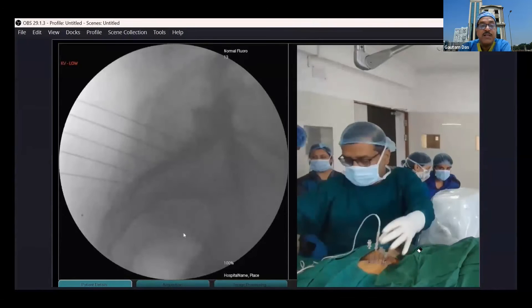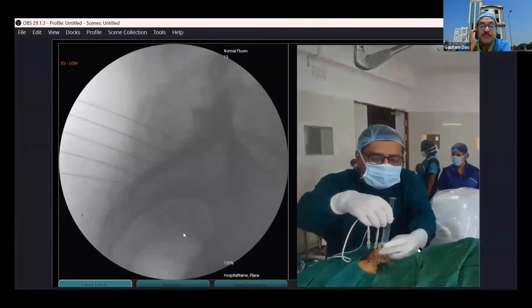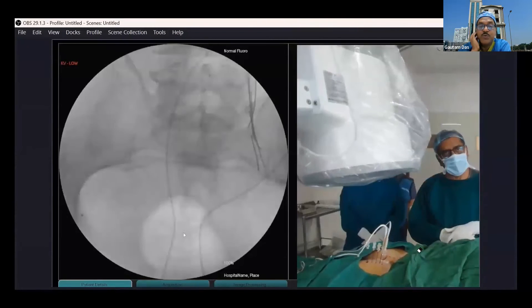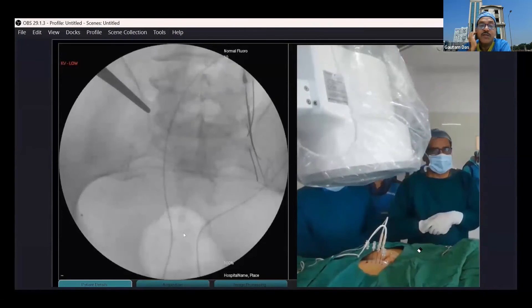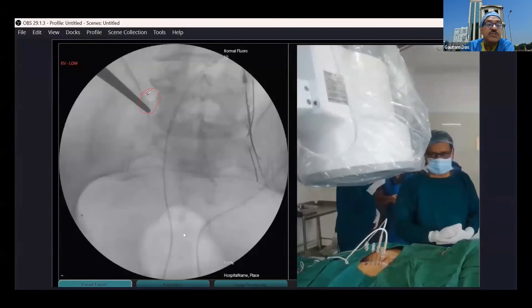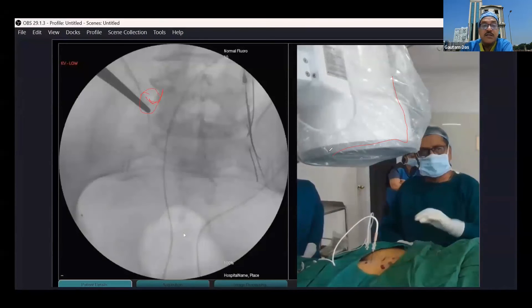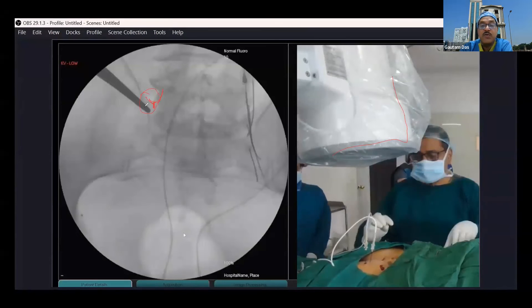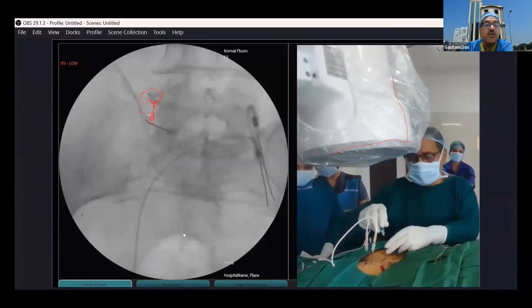On the right side, we placed five needles in the same way and the needles should be parallel. This should be checked both by the AP and lateral view, with the needle placed between the sacral foramina and the iliac crest. Then we place the needle for the L5 medial branch — this is the ala of the sacrum and the junction with the superior articular process. The C-arm should be caudally tilted approximately 10 to 15 degrees, and the needle should be taken in tunnel vision. This junction area is the target.